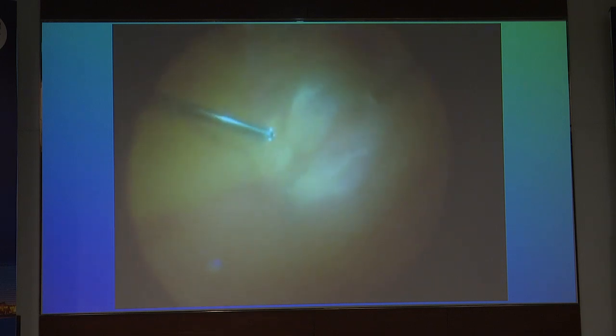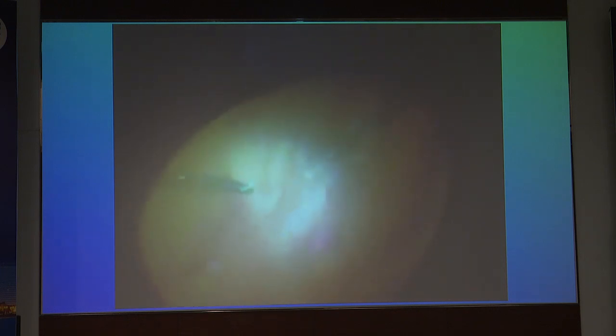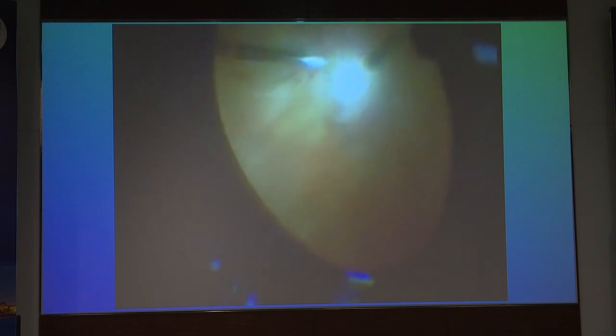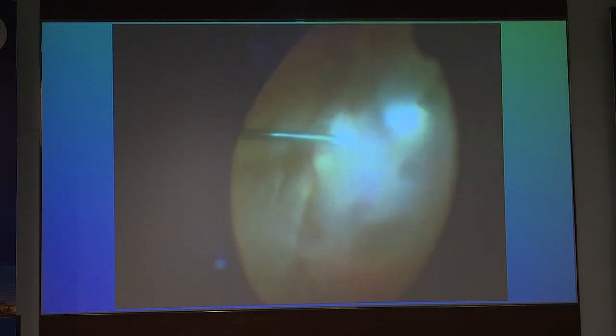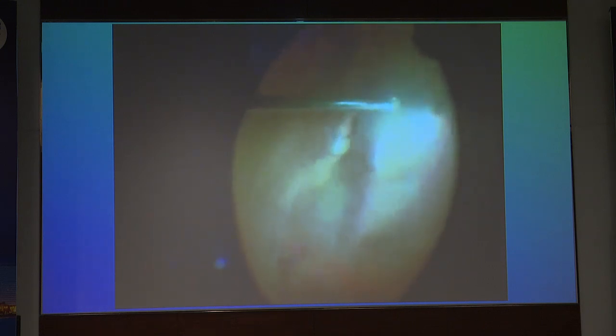and looking vigilantly for the intraocular foreign body within the vitreous hemorrhage. The idea is that if the foreign body is freed and it falls on the retina, it can also damage the retina, and when you are going to use the forceps, you can actually touch the retina and have a problem. So I am now clearing the vitreous hemorrhage and looking for the foreign body.